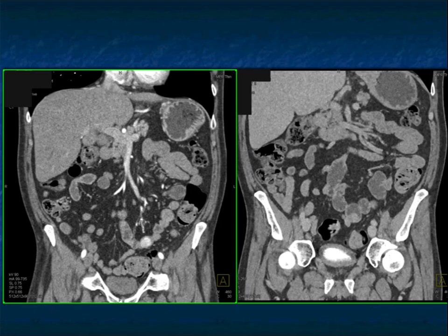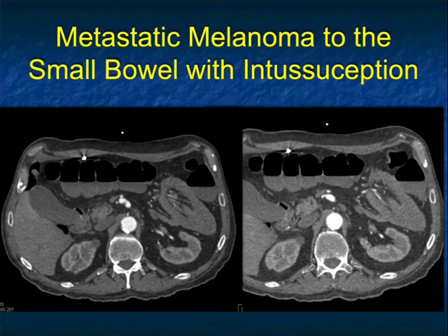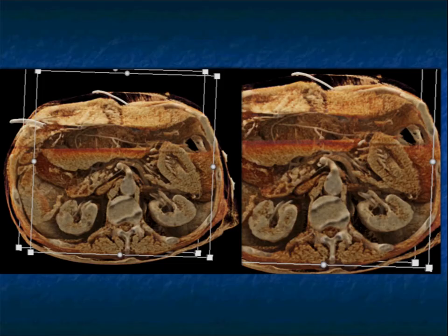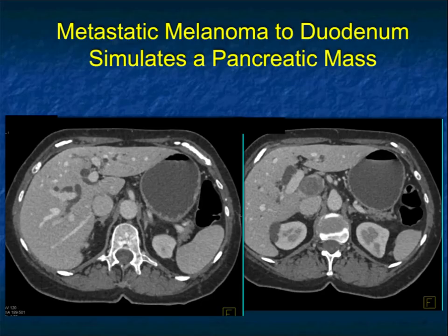Here you can see arterial to venous phase imaging where the lesion washes out. Another example: melanoma with intussusception. You can see the intussusception in the left upper quadrant, very nicely on the coronal view as well — that crescent sign — and on the cinematic view.